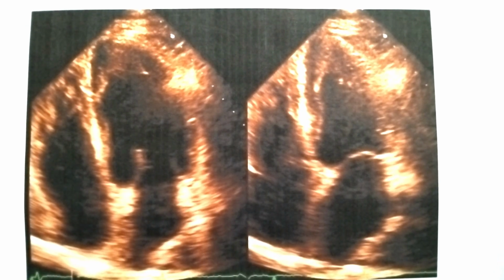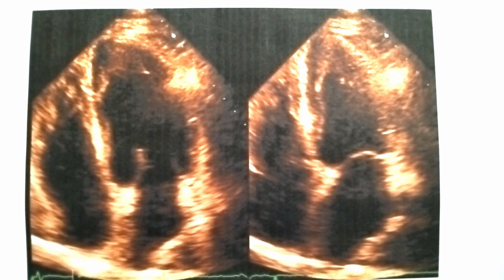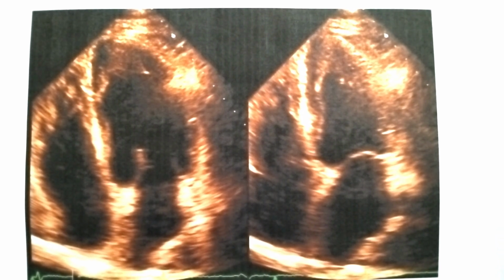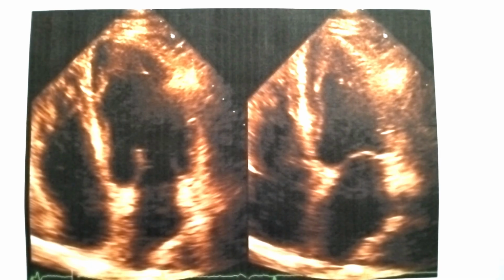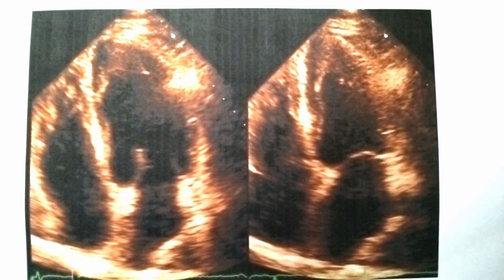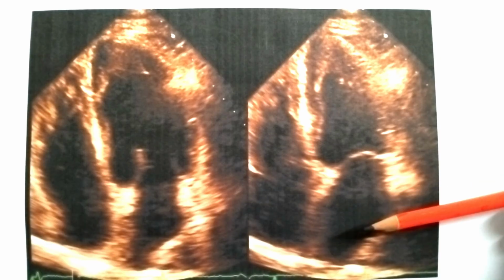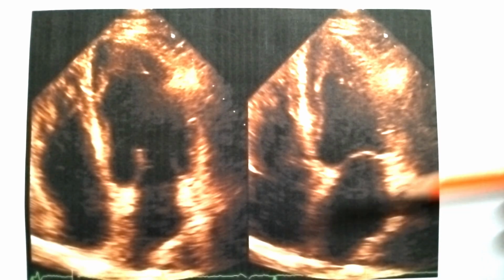From the parasternal echo window, we move on to the apical echo window. The transducer is placed over the cardiac apex, and the beam is directed upwards. Most of us adult echocardiographers use this image. This can be called an inverted image, because this is the lower portion, left ventricle, apex of left ventricle, and this is the upper portion, atria.